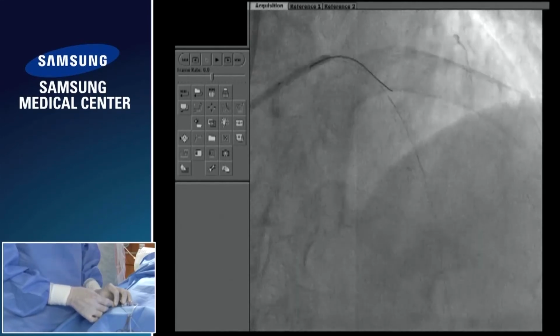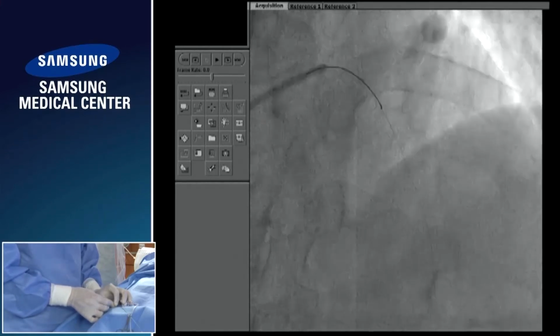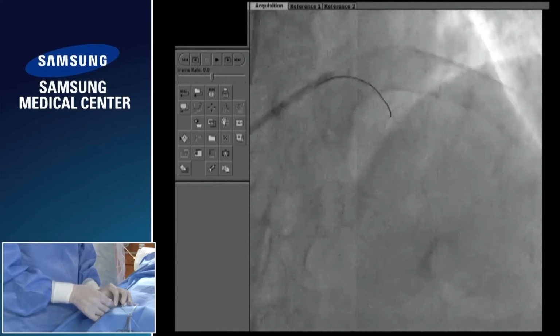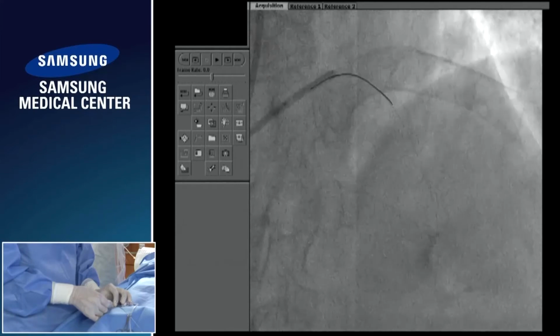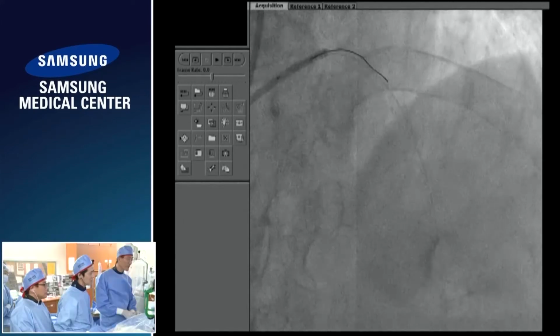It's kind of proximal. Yeah, I think so, it let me through. Try again. Yeah, I was through, but it's kind of proximal. Maybe there is no other way to do that, but I'll try once again. Oh, you're trying to cross on one of the distal struts there. As distal as possible, but not always possible.